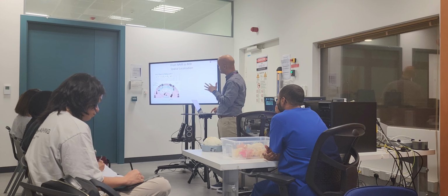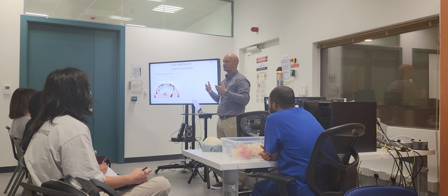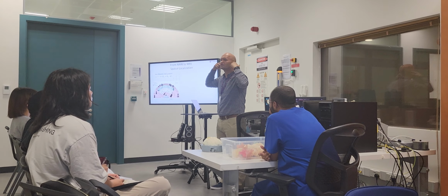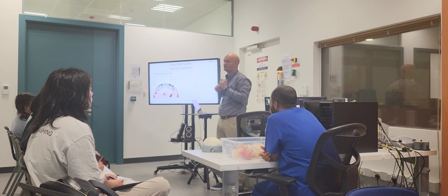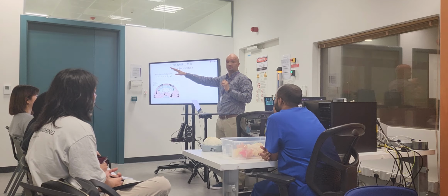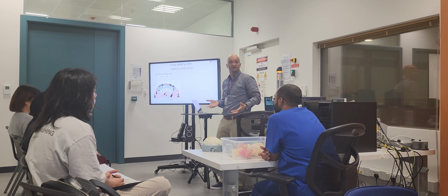Well, this is similar to an orchestra, by the way. If you close your eyes and the cello is on one side, the drum on another side, your ear is going to receive one signal, but your cochlea is doing a Fourier transform. It's breaking up the frequencies. So you can perceive, okay, I know that the cello is on the left. Then your ear recognizes that the cello is playing and the drum is silent. And when the drum is playing, it's the same one signal, but your cochlea, which looks like a snail, is actually doing a Fourier transform on the fly for you.